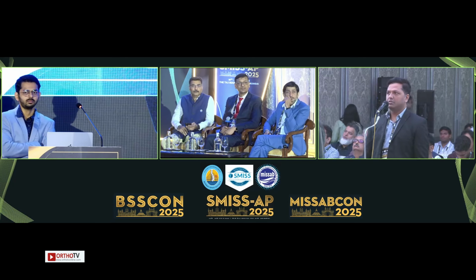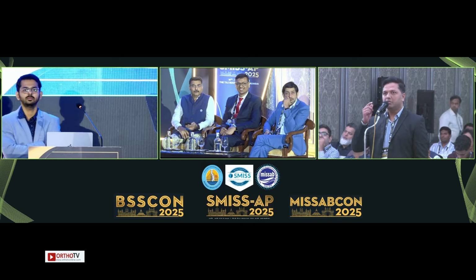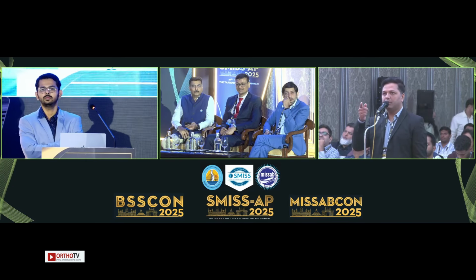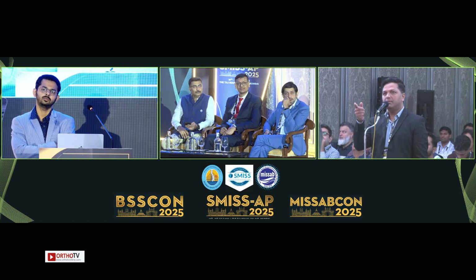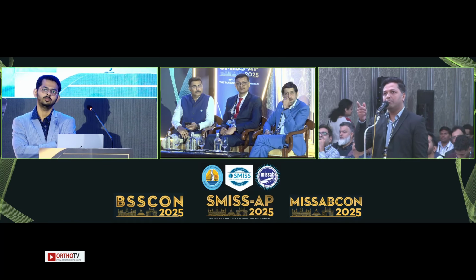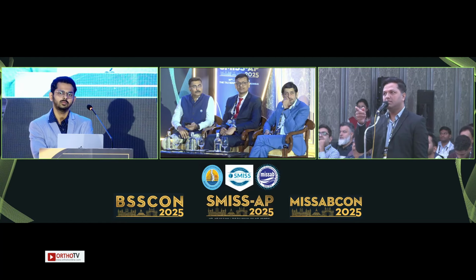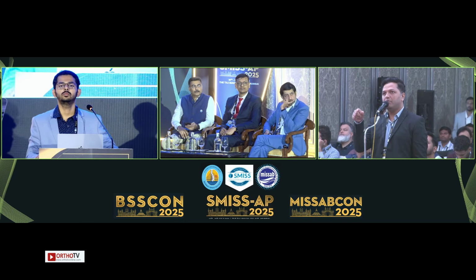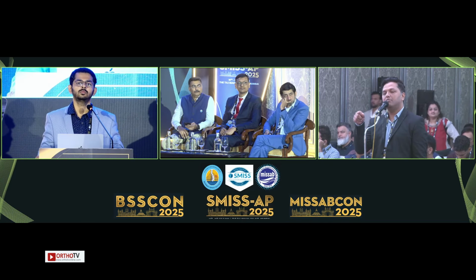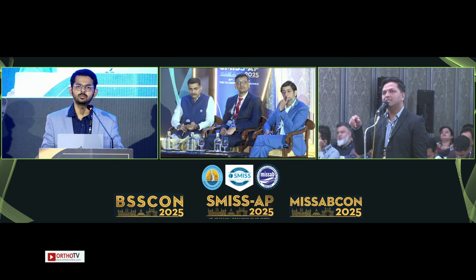Yeah, Dr. Harshvardhan Avrane. I have a question for the first 2 speakers about the Fapodis algorithm. Does the Fapodis algorithm apply to the upper lumbar spine? Because there is a significant difference between the interlaminar window and the disc height or disc level. And is the breadth of the pars considered? These 2 things are not considered in the Fapodis algorithm, particularly for the upper lumbar spine.